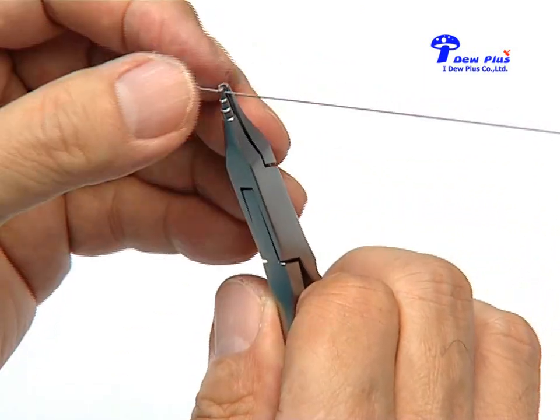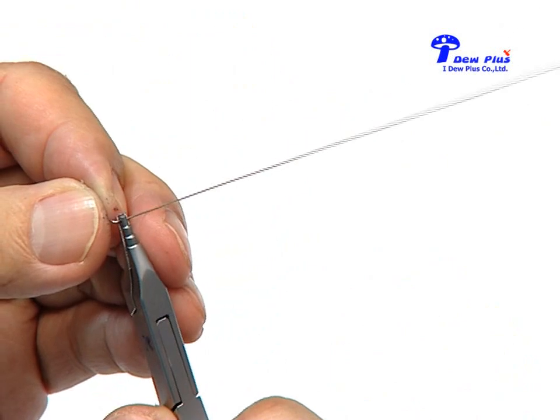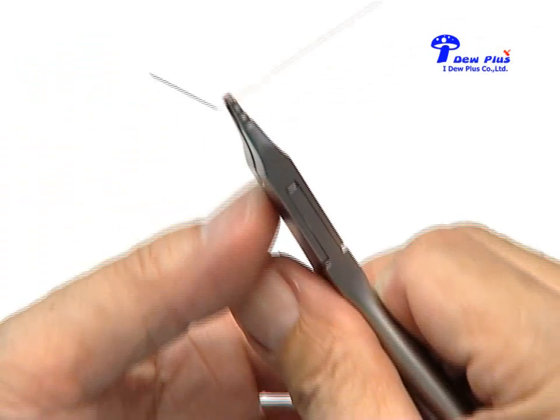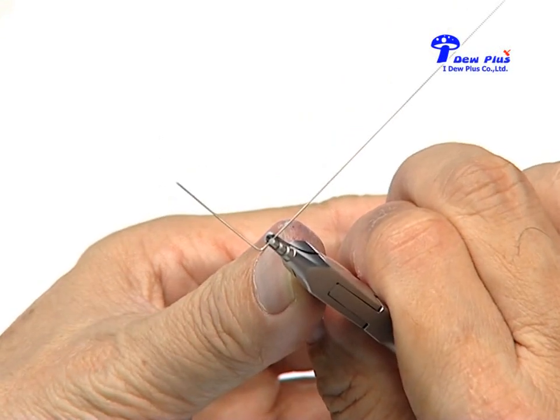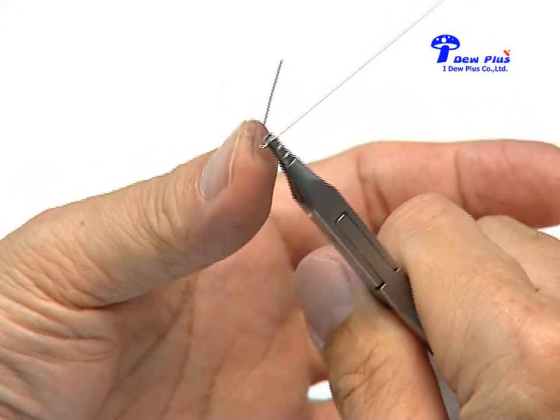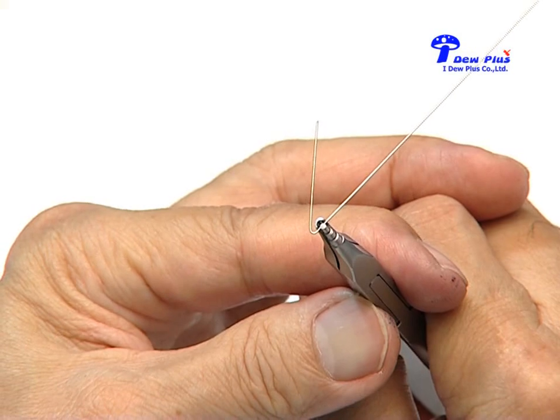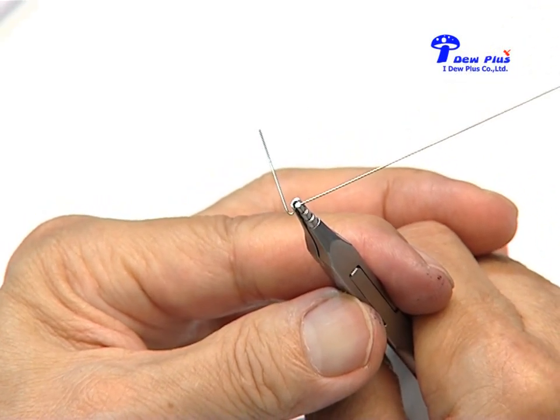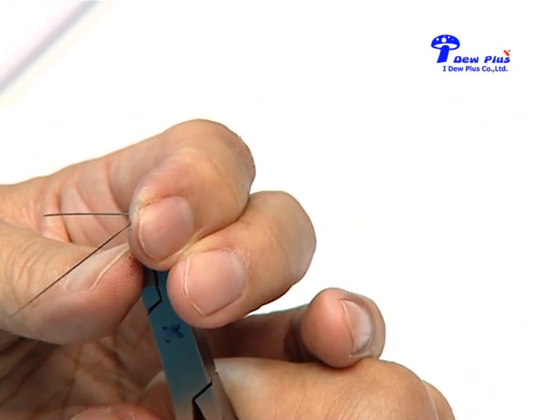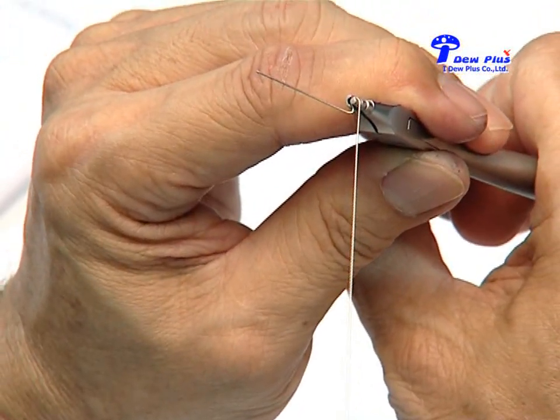The first step is bending 90 degrees as seen here. And then we slide the Tweed plier about 1 millimeter upward. And then we press further so that the legs of the wire are angulated 45 degrees to each other. And then the plier will be squeezed, and with the help of an index finger we turn the wire down. Now you can see the wire is angulated 45 degrees to the vertical plane and down.